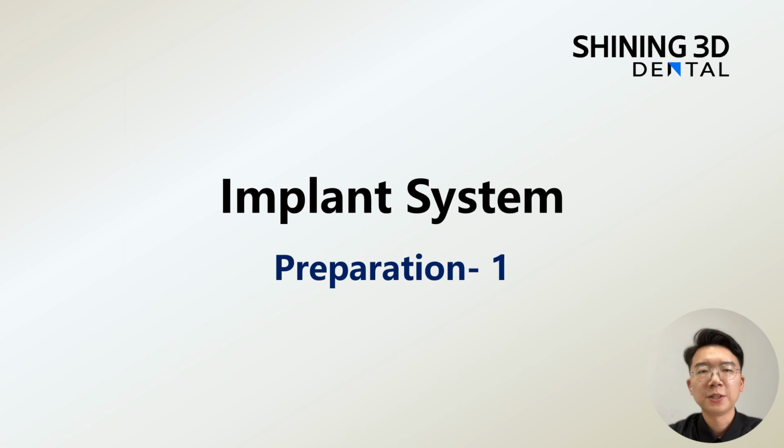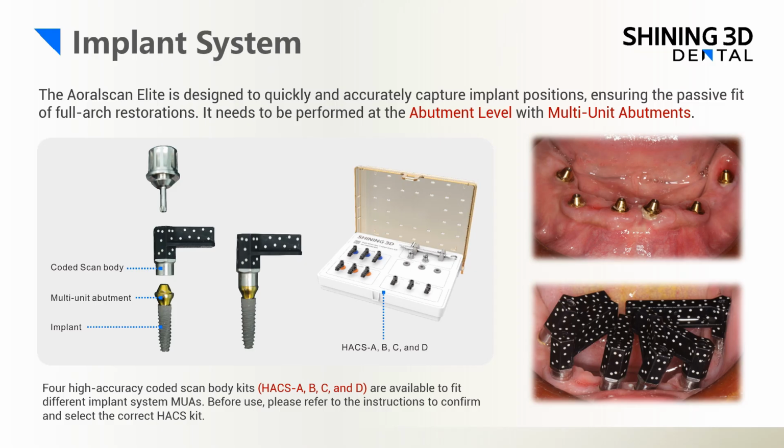Before scanning real patients, we need to complete a series of preparations, especially for the first-time use. These preparations include confirming the implant system and multi-unit abutments that we are using for this specific case, testing the coded scan bodies, learning how to mount the coded scan bodies, and determining the scanning strategy, among other things as well. As shown in the pictures on the right side of this slide, after implant placement, the multi-unit abutments need to be screwed into the implants.